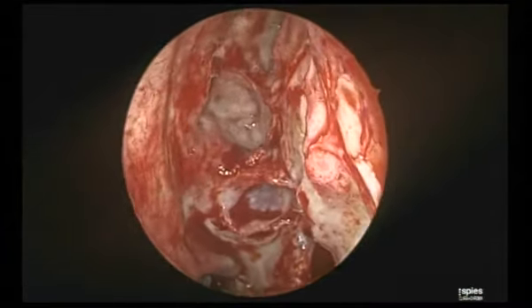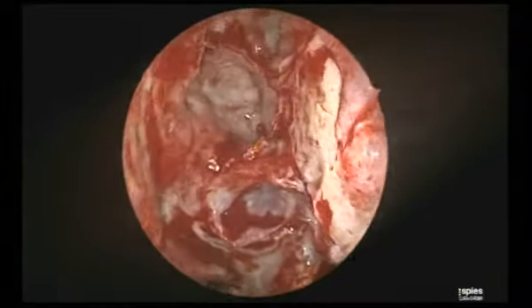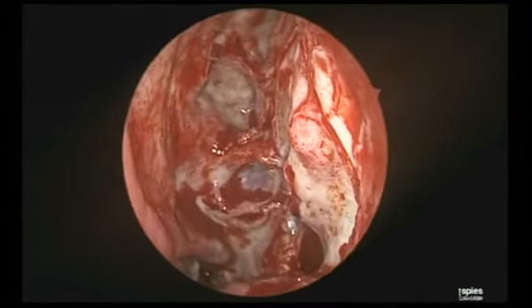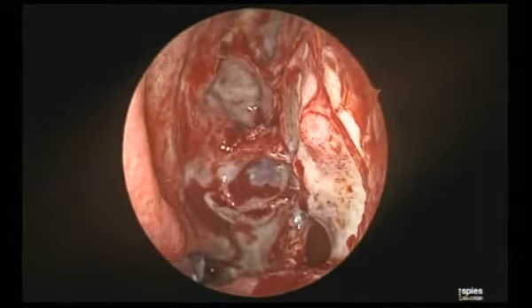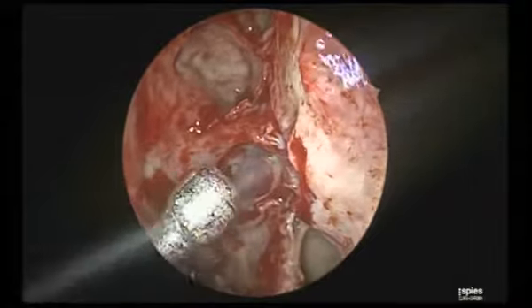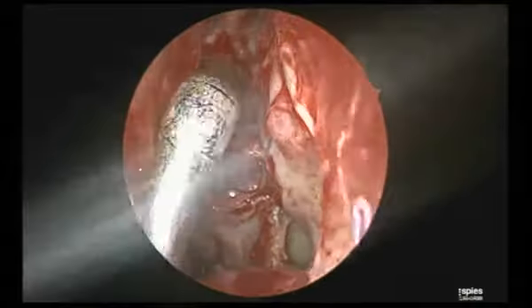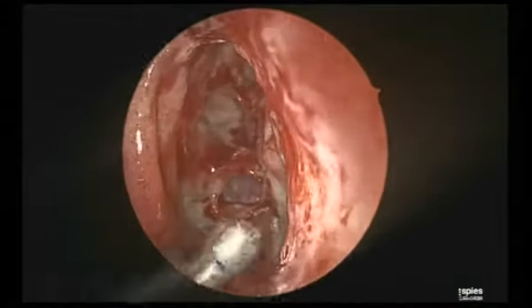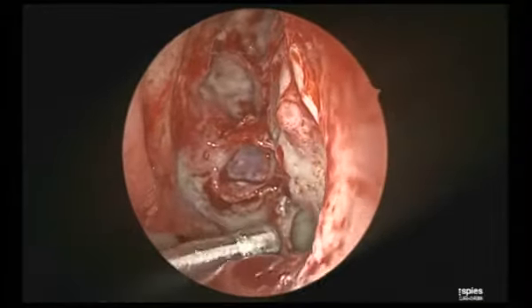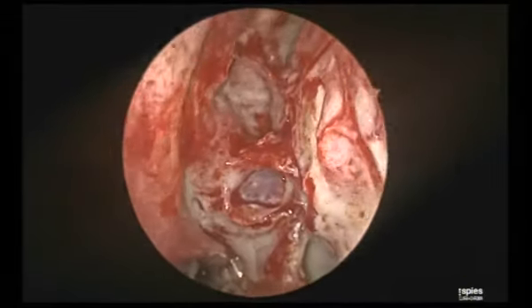Now there are two things left. We have done maxillary, anterior ethmoid, frontal, and we have developed our corridor. Can you see the corridor? Yes. Beautiful. A mucosalized corridor between the lamina and the middle turbinate. The only work left is the posterior ethmoid and the sphenoid sinus. Believe me, the most dangerous step in sinus surgery, the most potential to give complications, is the posterior ethmoidectomy. The most dreaded complications in sinus surgery tend to occur during posterior ethmoidectomy.